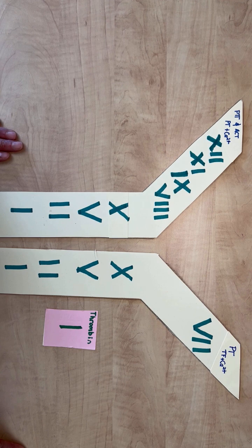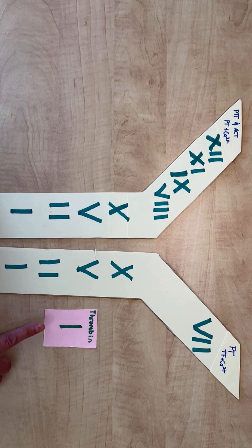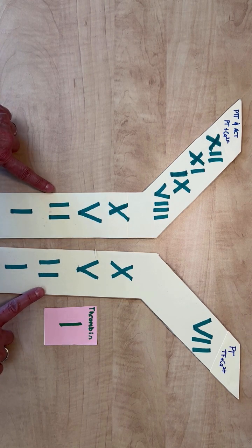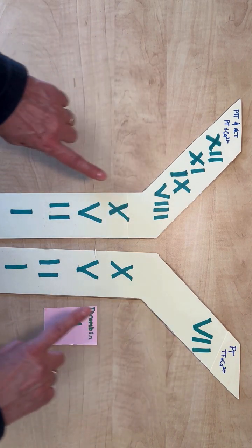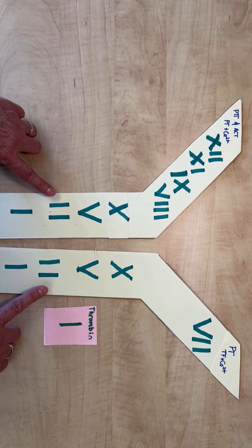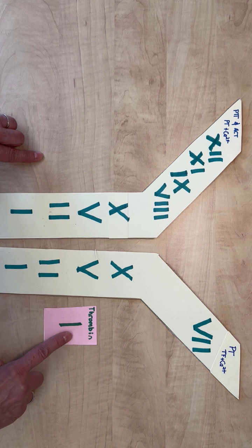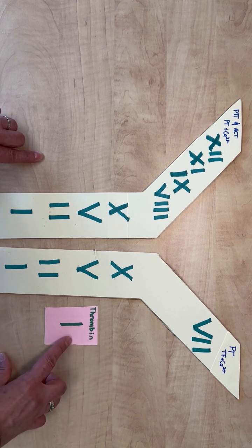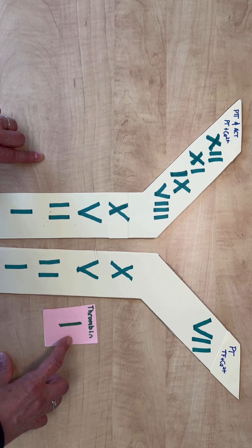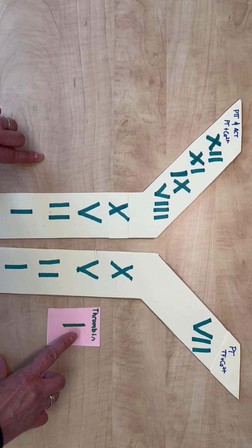The third test tube that may be run in some laboratories is the thrombin time test, or TT. To this test tube, we add an excess of thrombin, which is activated factor 2. So because we've skipped all of the intermediate steps by adding activated factor 2, all we are assessing is factor 1, or fibrinogen. And we add that activated thrombin to that tube and we wait for a clot to form. So this will allow us to assess the presence and functionality of fibrinogen.